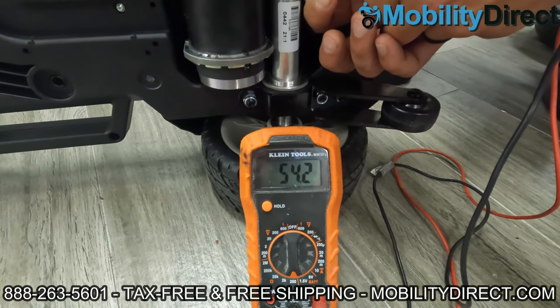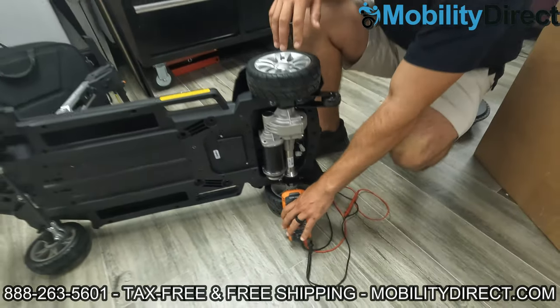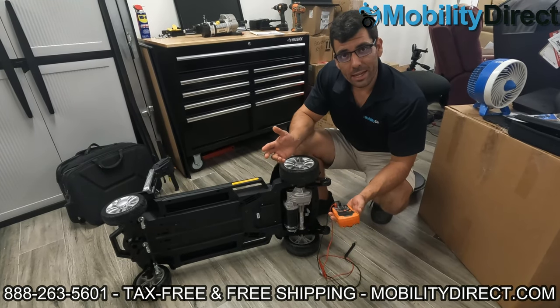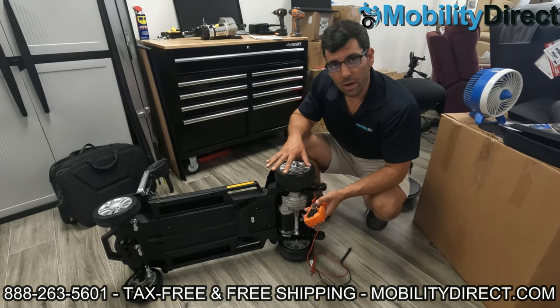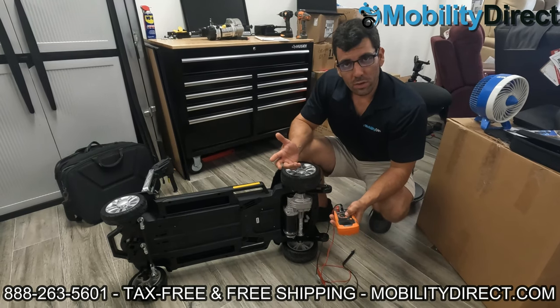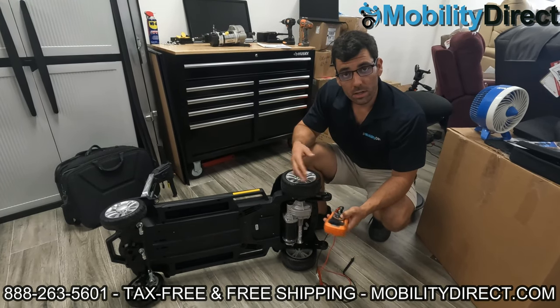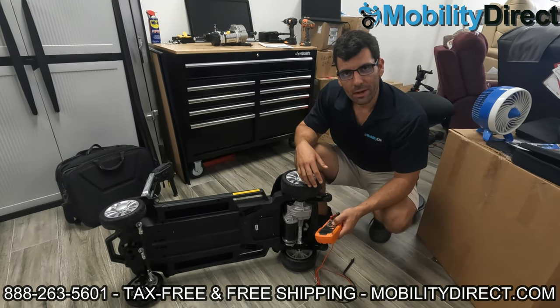It will vary over time depending on how old the scooter is. And that's basically how you diagnose and troubleshoot your electromagnetic braking systems on a mobility scooter. I hope you learned something today. Again, I'm Sergio with Mobility Direct. If you have any questions about getting replacement parts, we have a dedicated parts department. Unfortunately, we don't offer troubleshooting by phone for every person that owns a mobility scooter — contact your dealer. If you're a customer of ours, we'd be happy to help you. Just give us a call, provide us with your order number, and we'll help you out.